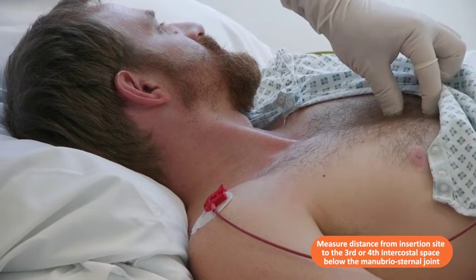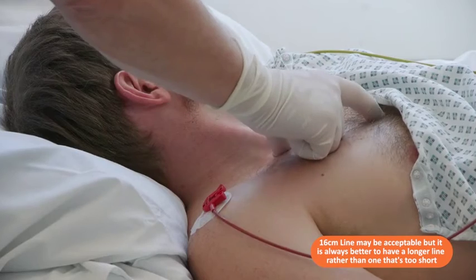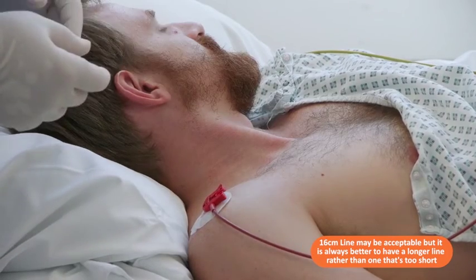So in this instance, using a relatively low approach on the right internal jugular vein, a 16 centimeter line may be long enough, but we can always go a bit longer, up to a 20 centimeter line, because it's usually preferable to have a line that's too long, so that you can reach the cavo-atrial junction but have extra line on the outside, rather than having a line that's too short and not having enough space on the outside of the line for your securement and fixation system, and having to leave the line too short in the superior vena cava.